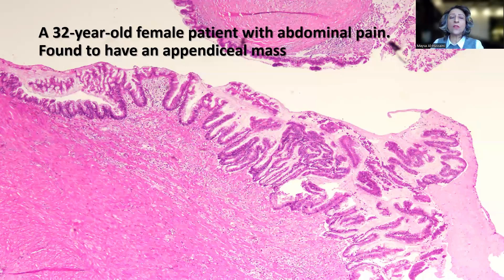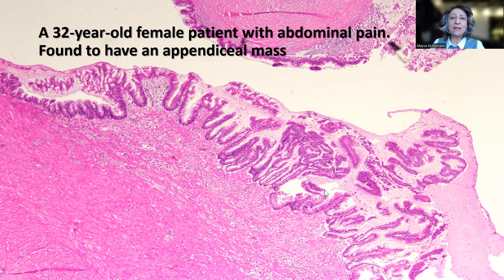This is a case of a 32-year-old female patient who presented with lower abdominal pain and was found to have an appendiceal enlargement suspicious for a mass. This is the low-power magnification of the resected appendix.